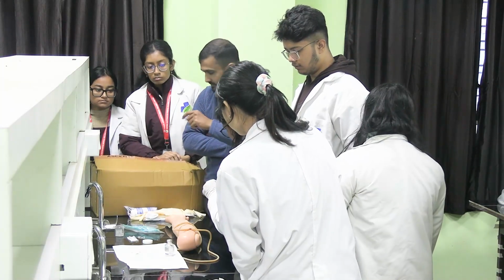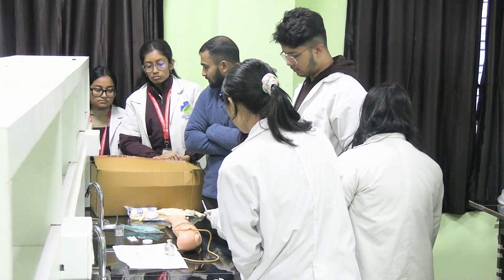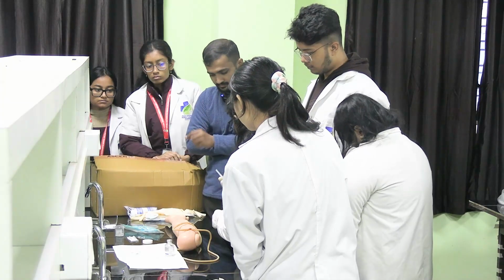You cannot touch the tip of the syringe. This is also another point. Open it like this.